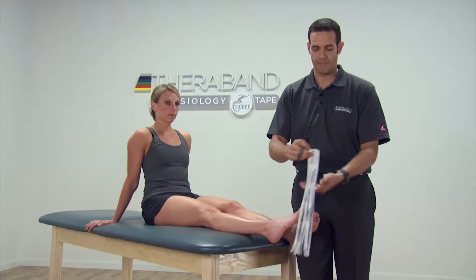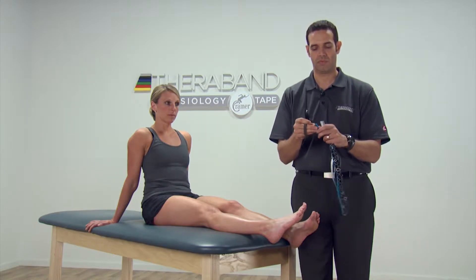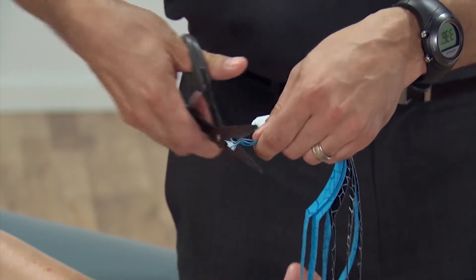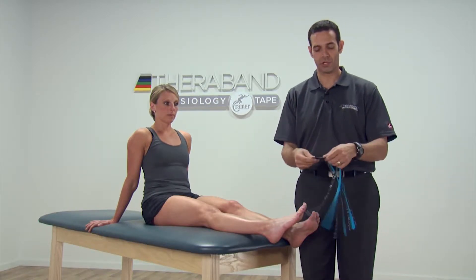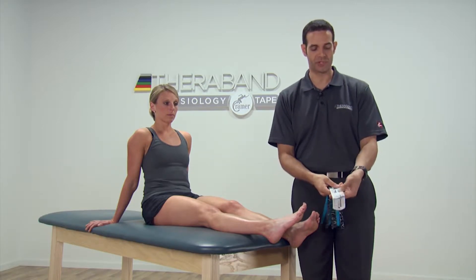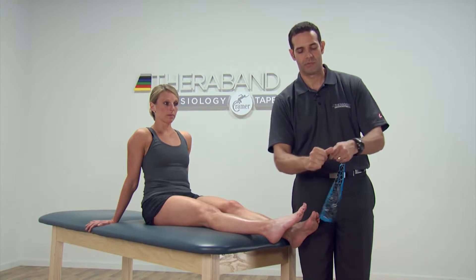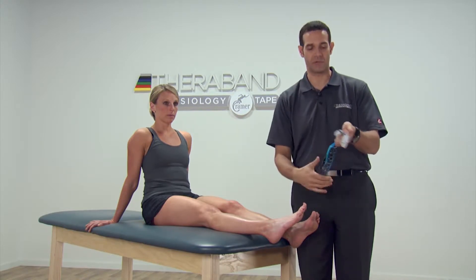This is called the fan cut, and down at the tails, I tend to bunch them together. This is a little unique from what we've done in the past with our tails. What you're going to do is break your base above the tails, so now all four of them are still connected on the strip. Then down at the tails, at the very end, we're going to break again so that all of the tails individually have one piece that we can peel off of the base.